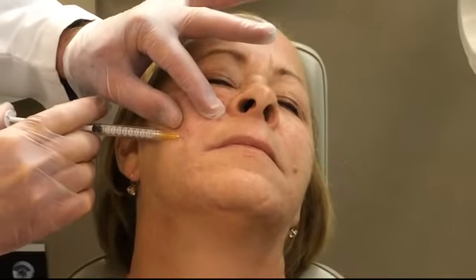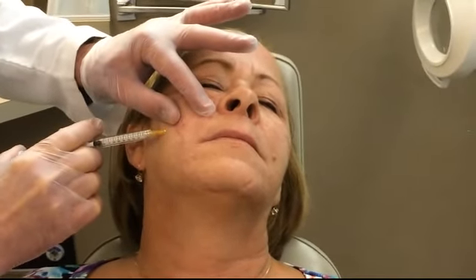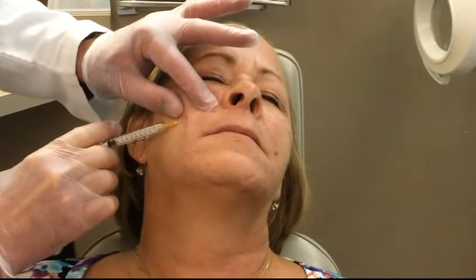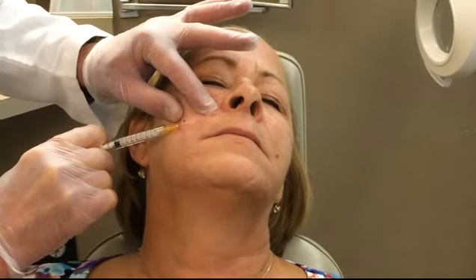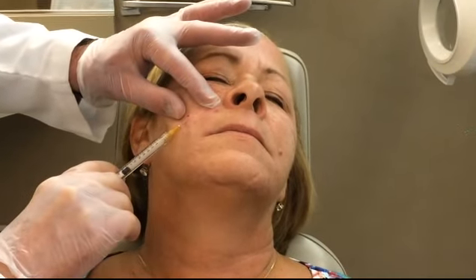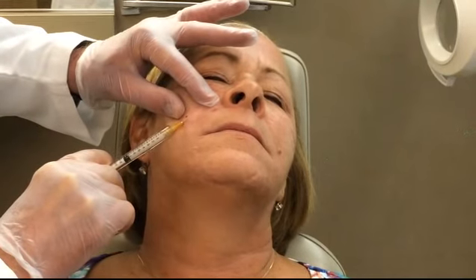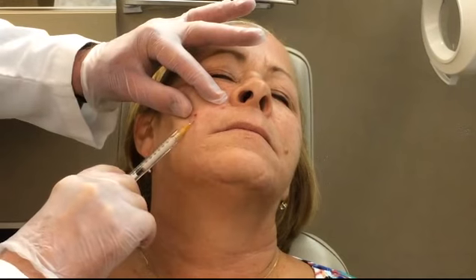I know that was just a little bit touchy right there. Now we're going to actually inject some material into the area. You see the material flows very, very nicely there. We go in various directions in that space that we created. And this contains a little bit of lidocaine in it, so that it should feel a little bit better.